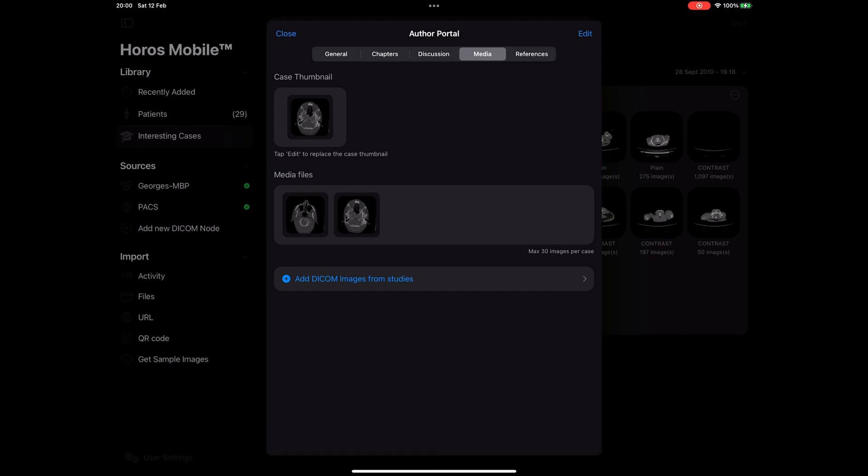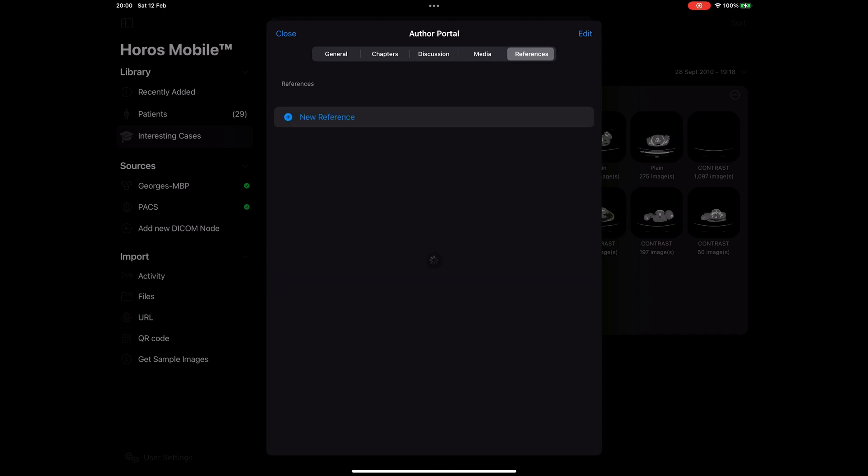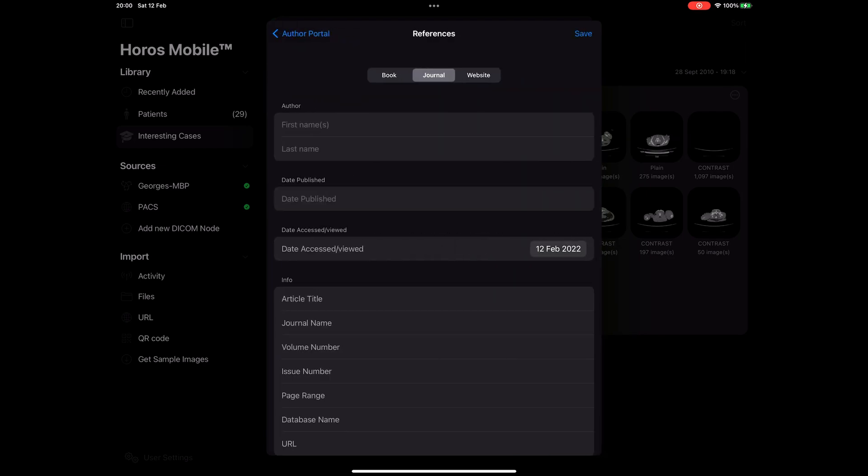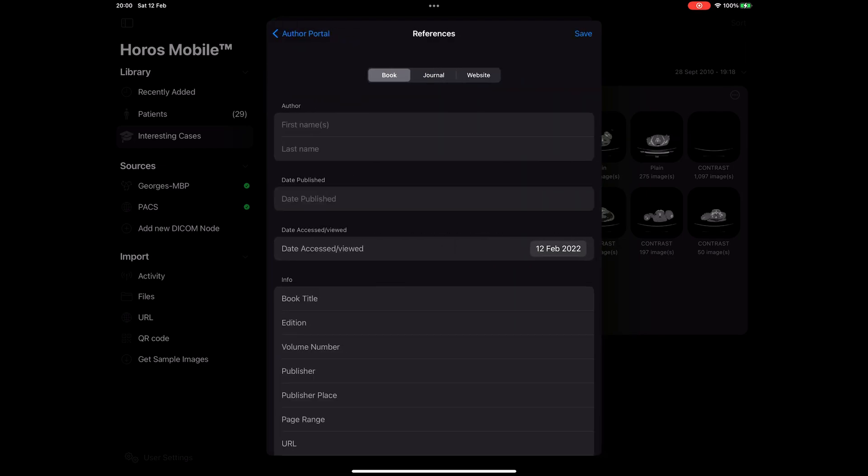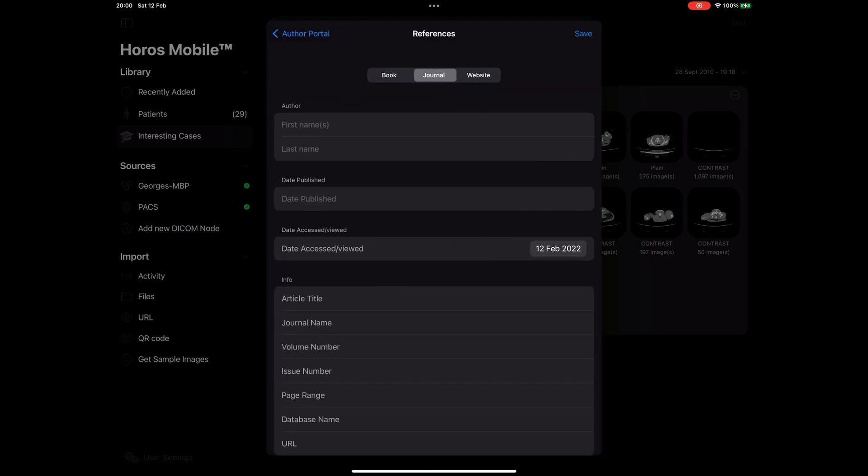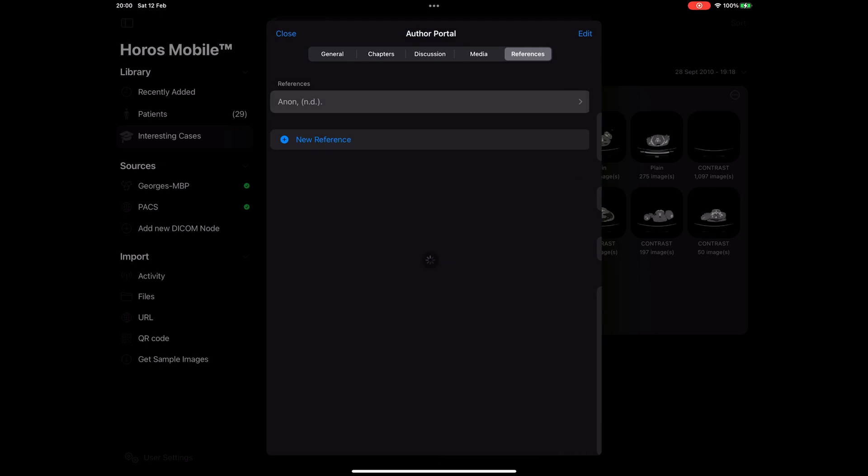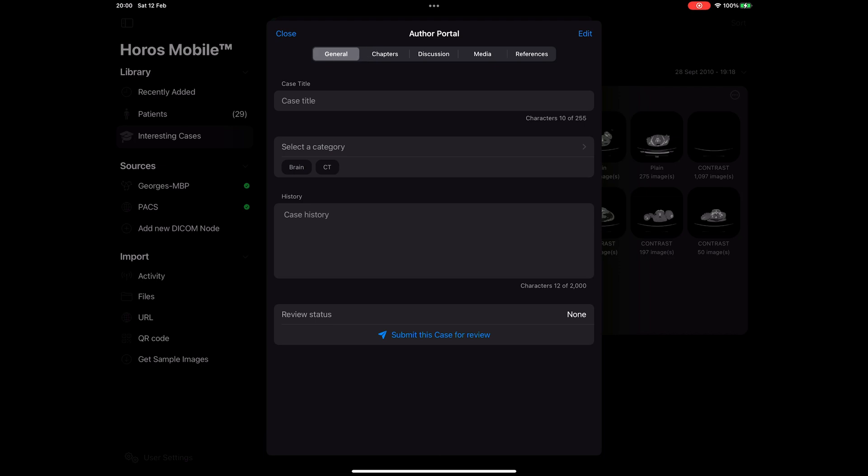On the last tab we can add references. We designed the app in such a way that it's super easy to create references based on the Harvard referencing system. This step is optional. Once I complete all my chapters and questions for each chapter, I can go back to the general tab and submit my case.